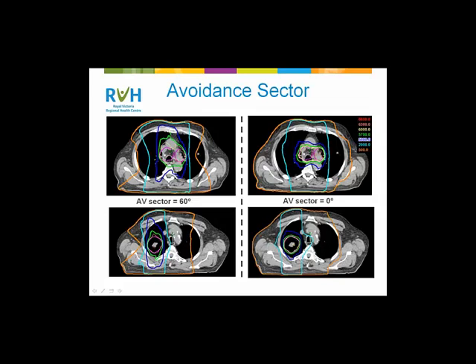How do you combine, merge the base dose plans and the RapidArc plan for delivery? You do, but there's not a really slick way to do this in the planning system. If you're thinking of when you merge subfields, for example, it's very automated in the system. What we have to do is, when we're done, we have the base dose plan, which is separate from the plan that has the partial arc. And what we do is we copy the base dose fields and paste them into the arc plan. And then we do a dose calculation with preset values, copy the values from the base dose into the current plan and forward calculate that. So you have to manually copy the fields and put them into the arc plan so that you end up with all the fields in one plan to deliver every day. Okay?